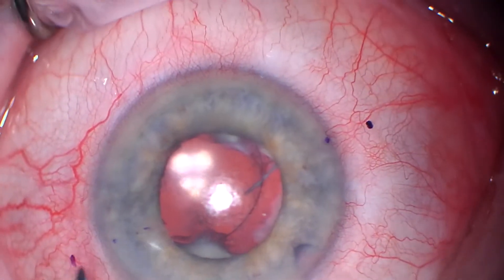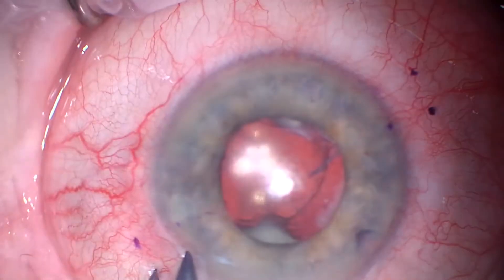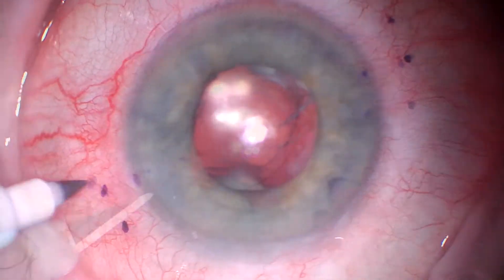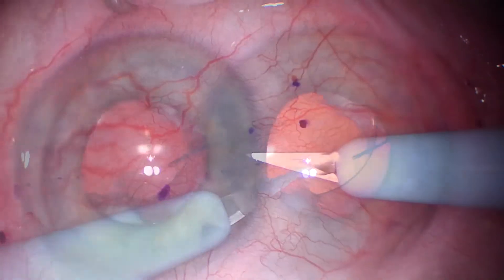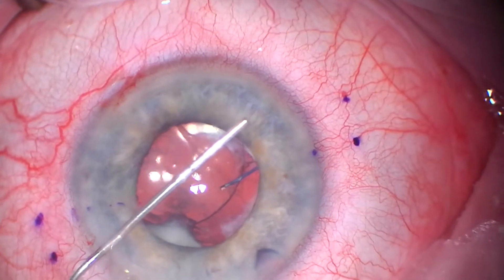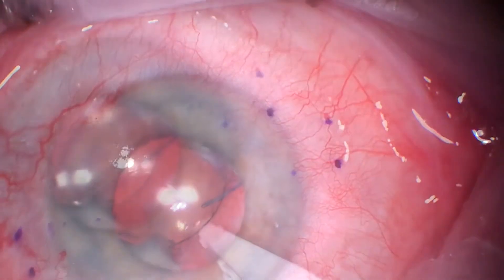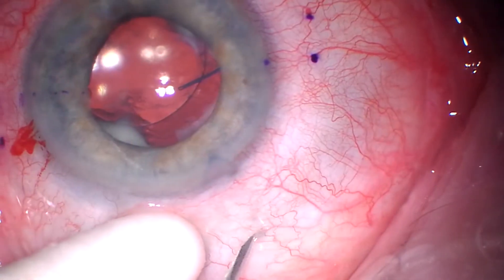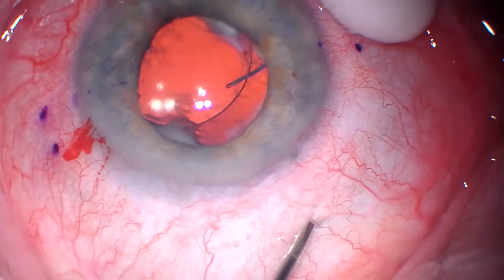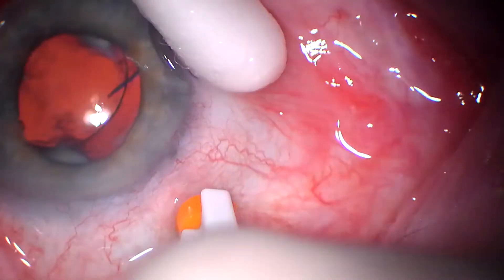Here we're marking two and a half millimeters back from the limbus, as well as some extra marks that outline where the haptic tunnel will be on each side. We're making a paracentesis just superior to each of those marks and another paracentesis inferiorly, filling the eye with Viscote. We'll place a 23-gauge trocar — these particular trocars are from a company that starts with an M; I like them a lot better.